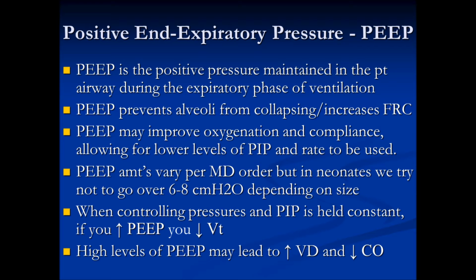All right, last bullet says high levels of PEEP may lead to increased dead space and decrease cardiac output. Again, this is not new information. You should already understand these concepts.